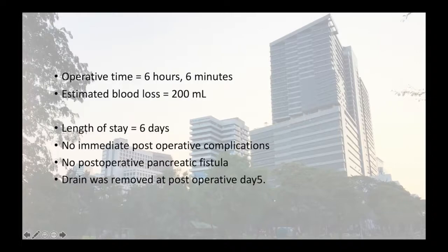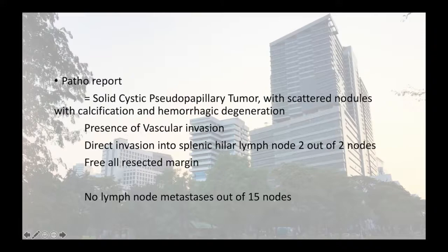The patient recovered well. Histological report was solid cystic pseudopapillary tumor with vascular invasion. All resected margins were free.